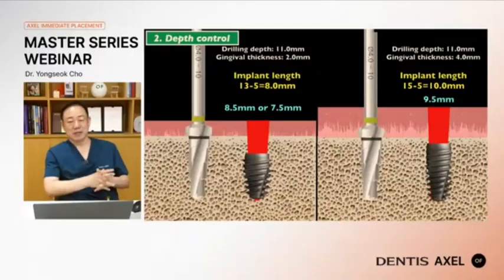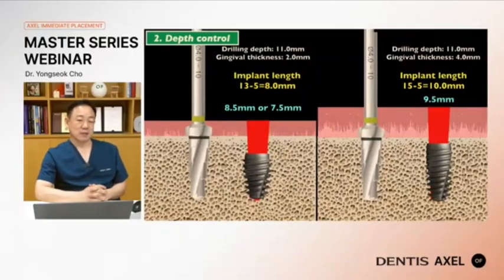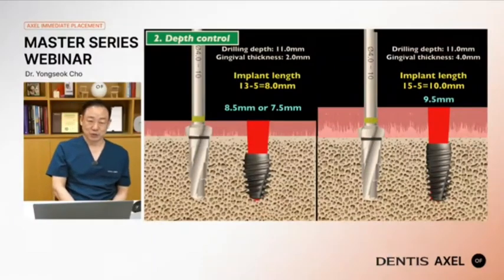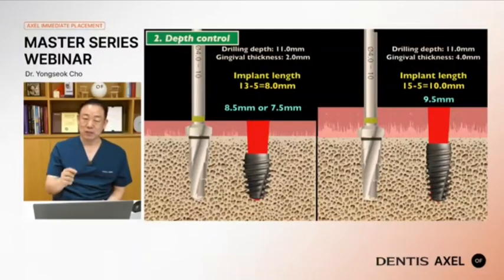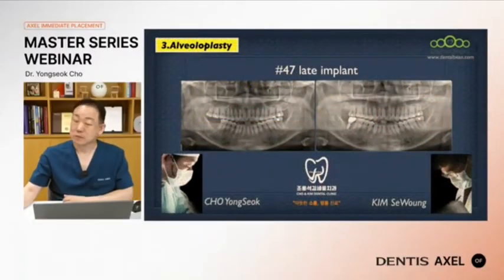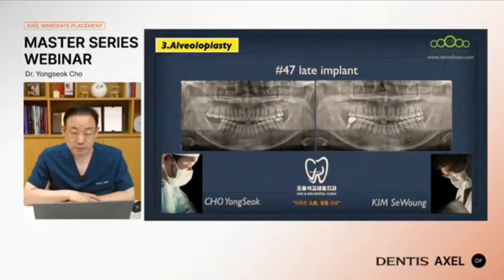And think about the late implant case in the mandibular molar site. Some patients have thick soft tissue, the right picture, but mostly it is the left picture situation. In many mandibular molar healed sites, patients have thin soft tissue. So you must use a relatively long drill to prep the osteotomy. Okay, here is another second molar missing case.